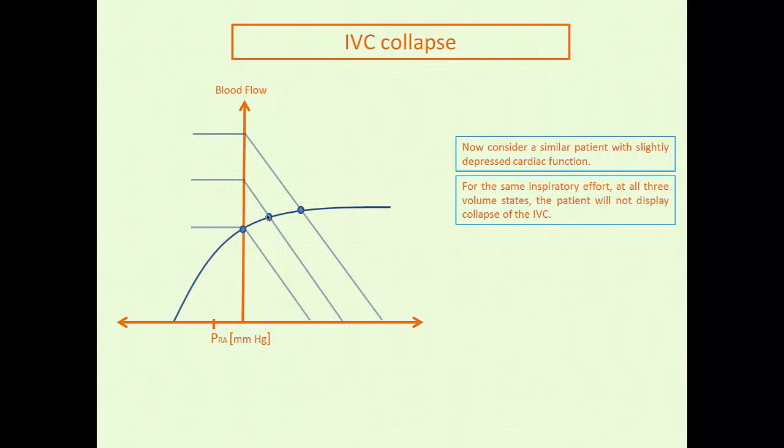That makes sense. This patient is euvolemic. There's minimal decrease in right atrial pressure with inspiration, and therefore the minimal decrease in right atrial pressure retards collapsing of the IVC, as the rise in intra-abdominal pressure cannot supersede the drop in right atrial pressure.